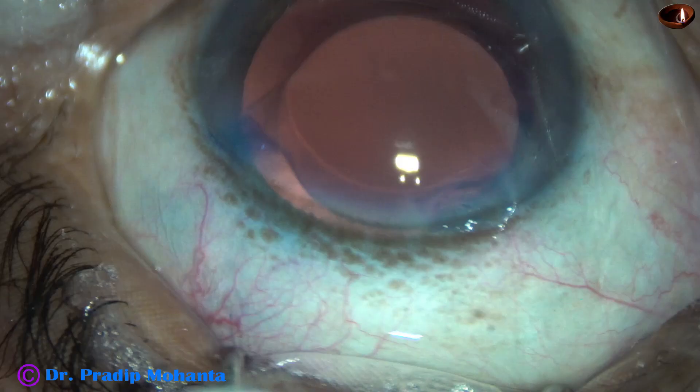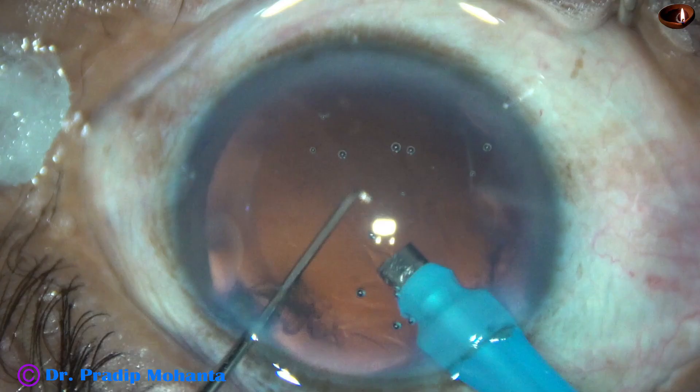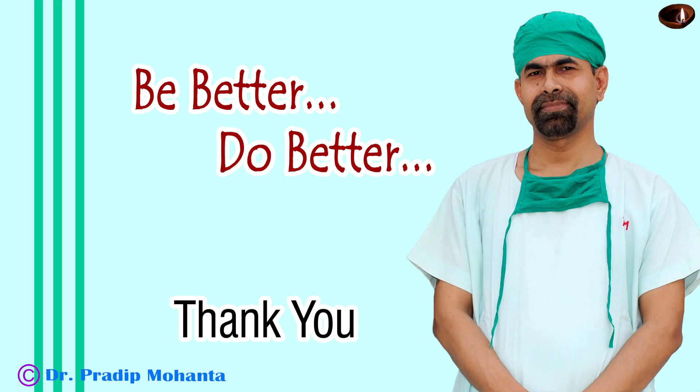One more thing noticed in this case is that there is no wound burn. The ultrasonic energy was applied in continuous mode at 80%, and still there is no wound burn. This is because of the beautiful design of the phaco needle of the Oertli Catarex phaco machine. Thank you very much for your attention. I have no financial interest in any of the equipment or products mentioned in this video.